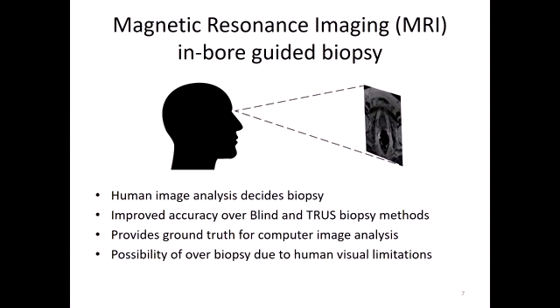Also, just the sheer amount of images in a day that someone might have to look at, fatigue sets in, and also the experience level of the particular radiologist that's looking at these images. Obviously, the more experience you have, the better you're going to be at differentiating. And that ties in with, there's generally no set standard for what is a malignant looking image and what is a benign looking image. And so that ties back into the experience level of the radiologist.